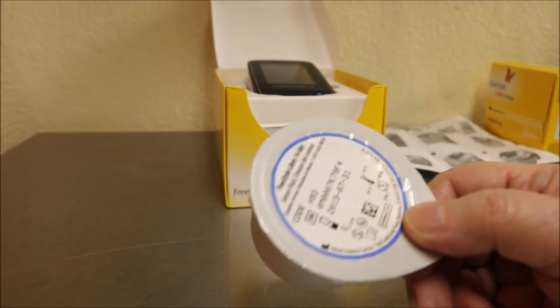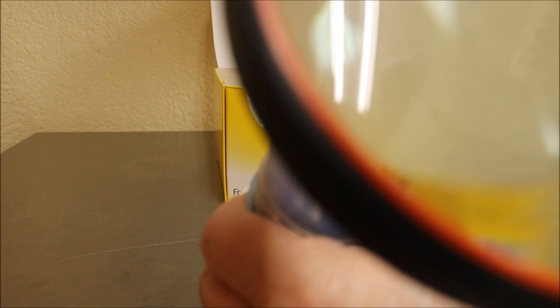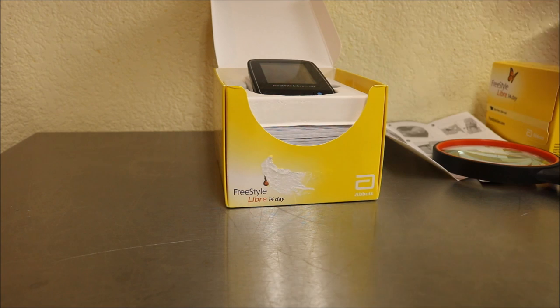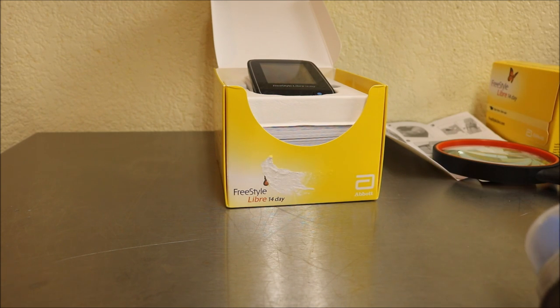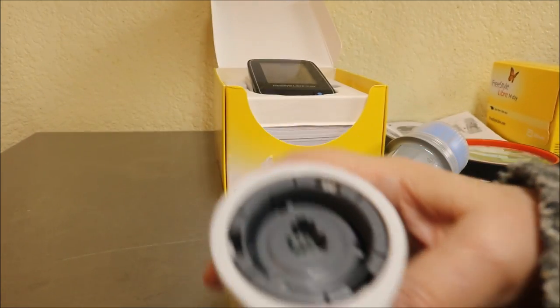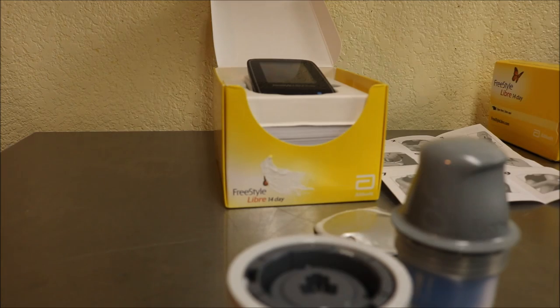I got two sensors — this one will be used in two weeks. First thing when getting ready to apply: check the code on the back of the containers and make sure they match. Don't they know people with diabetes have something called retinopathy? I've been a diabetic for a long time. Now you peel the backing off — that's what the inside of the sensor looks like. There's a coil and spring, just like a finger sticker.